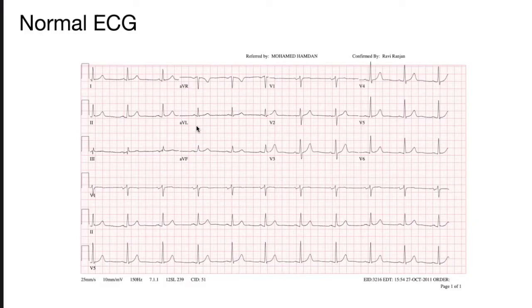So, 2 more pieces of information, and then I'm going to have you guys do some math. Everybody's favorite thing to do. So you can see on there, there are these little pink boxes. There are actually boxes inside of those boxes, but just take a look at the more clear ones. And each box is 5 millimeters. And then we know that every 25 millimeters equals 1 second.